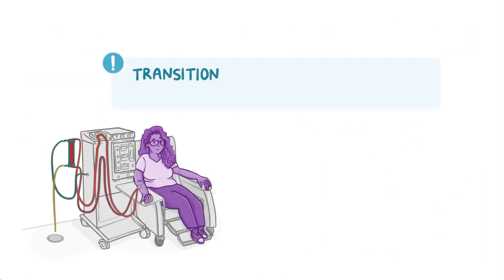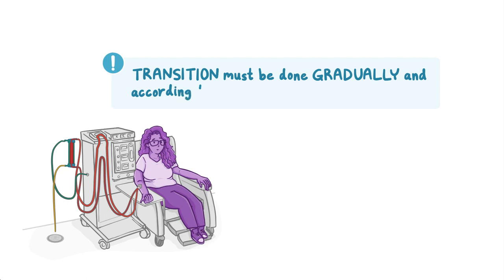Importantly, the transition from hemodialysis to HDF must be done gradually and modified according to the individual patient's characteristics to avoid any potential complications.